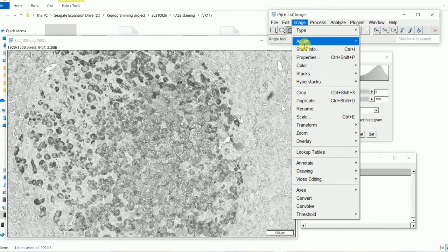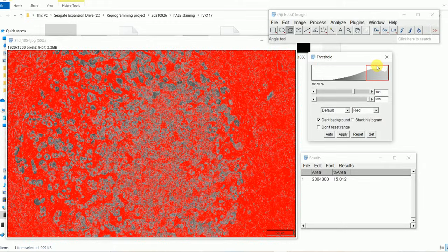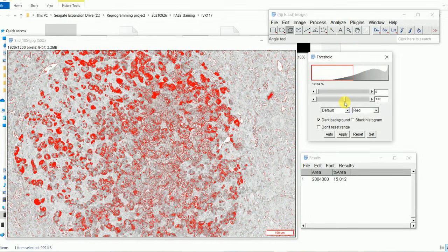After this, you will go to image, then adjust, and then threshold. Okay, image, adjust, threshold, and then you will play around with these two things. I'm just going to keep things default here. You see here this thing also appears red, but in our original image this was not red, right? If we quantify this, it will not reflect our true value, therefore we must get rid of that black thing that was present in our original image.